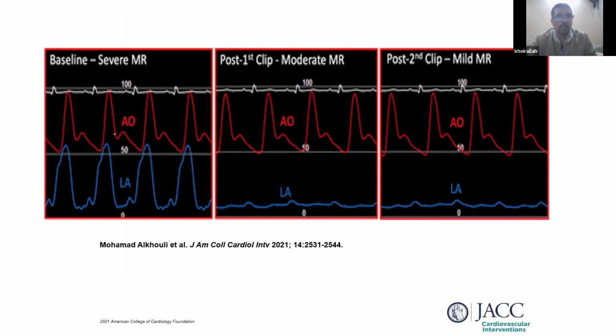Look here. Now, invasive hemodynamics is sometimes used more than before. Why? We said echo replaced invasive hemodynamics, but now there is a revival because of structural heart intervention. They already have a catheter in there and they are doing a procedure like ballooning and clip and whatever, so they can measure the pressure right away. For example here, this patient has severe MR.